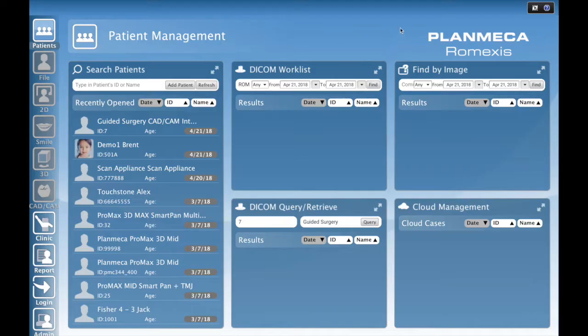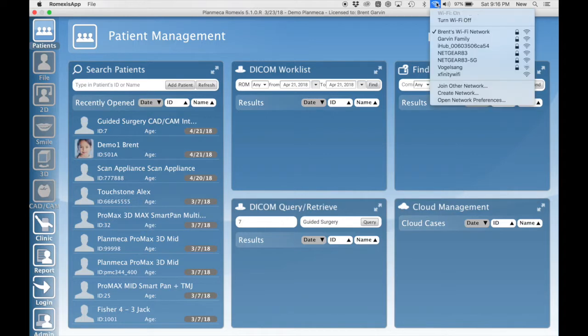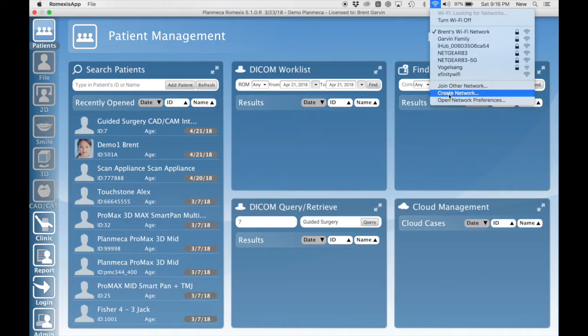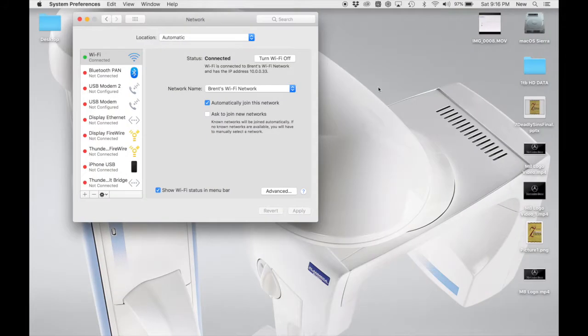Now as far as Mac, go to your Wi-Fi connection and go to Open Network Preferences, and you'll see your IP address right there on that first screen.